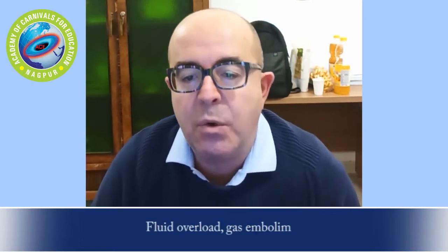Perforation of the uterus can occur with dilators, mechanical grasping tools, and the resectoscope system. Laparoscopy must be performed if bowel injury is suspected, where there appears to be a large perforation, or in the presence of heavy bleeding. If continuous bleeding after resection is present, a Foley catheter can be inserted in the uterine cavity and distended with up to 40 ml of saline until the bleeding settles from a tamponade effect. The balloon can be removed if the bleeding has settled in a few hours.